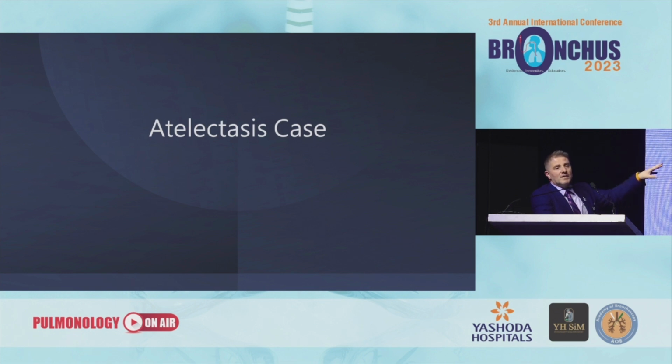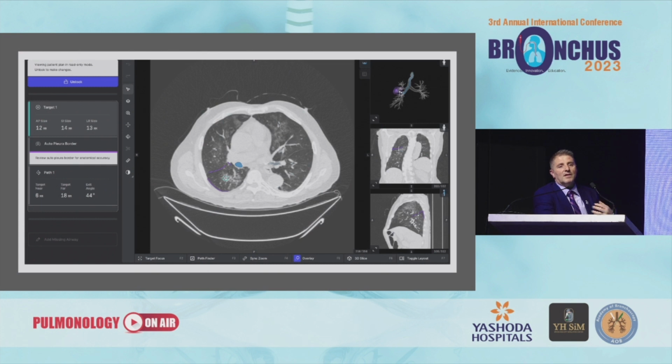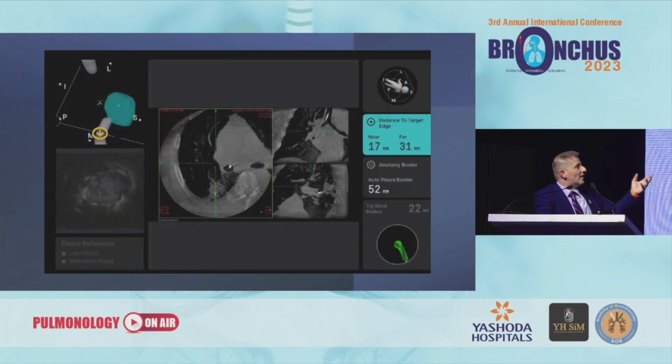Why I re-emphasize the anesthesia part is because this is an example where the anesthesia machine unfortunately failed when we were doing the induction, and the circuit had a leak, and we had to bag the patient for 10 minutes. Atelectasis formed, and now we are going after a 10 millimeter lung nodule, but unfortunately it is sitting in the shadow, and even with the radial EBUS it is very confusing.